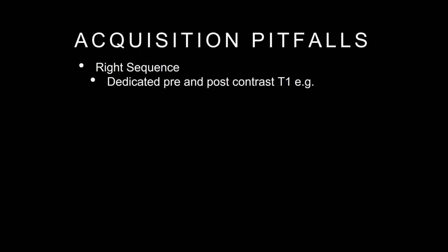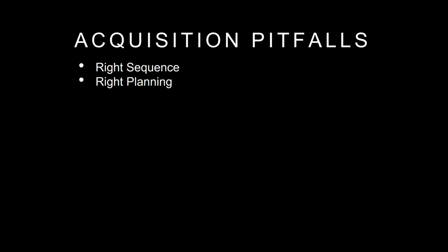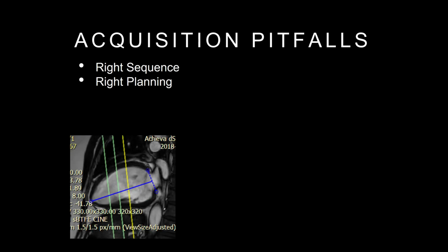In terms of acquisition, make sure it's the right sequence. We were a few months in before we realized that our post-contrast MOLLIs were basically the native MOLLI rerun after contrast, but in fact, Philips has two different sequences for native and post-contrast. So that was something we weren't aware of and subsequently incorporated.